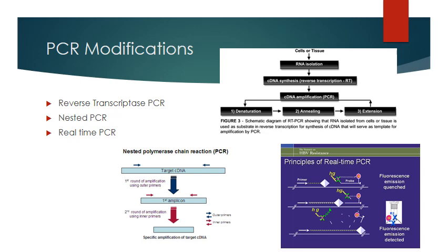And the other thing they can use it for, for example in Hep C, is to be able to determine, because remember in hepatitis C, we actually have the word cure being used with some of these treatments. So if you do a real-time PCR and you find out there's none in the patient's sample, that's how we can come out with that result.